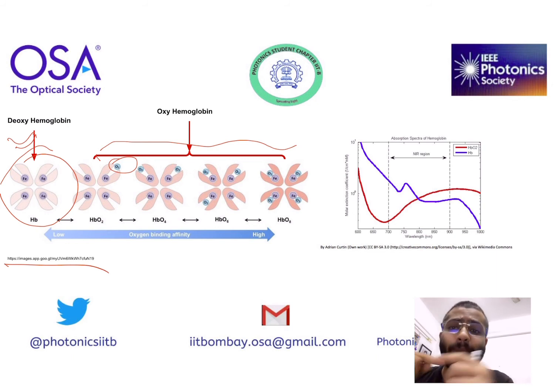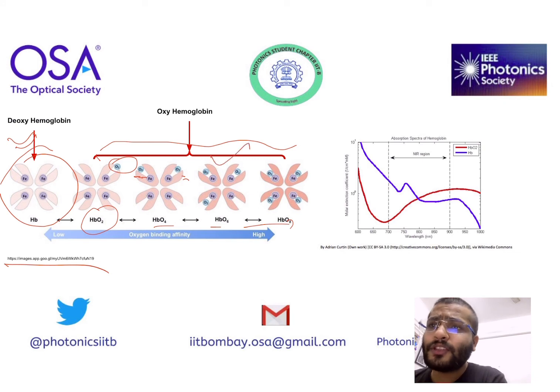The blood flowing in our arteries has both deoxyhemoglobin and oxyhemoglobin. One hemoglobin can bind 4 oxygen molecules. Okay, so if you are in this situation or in this situation, then you have no need to worry.